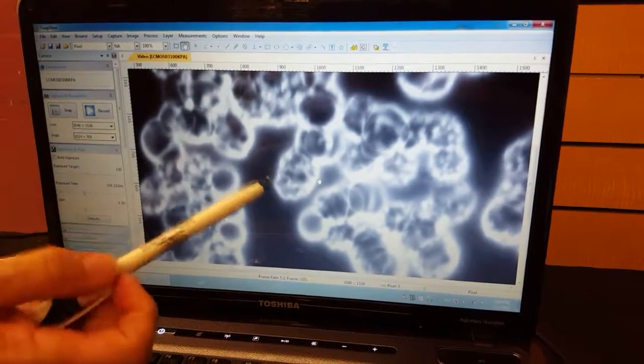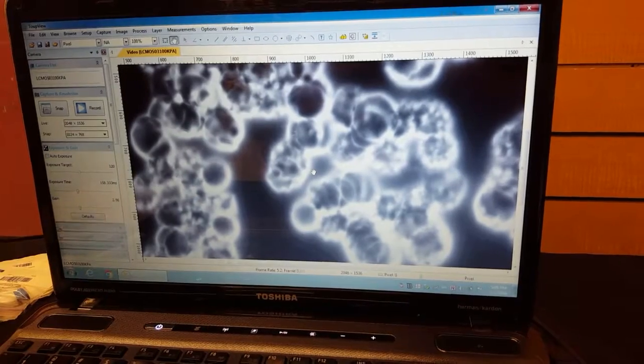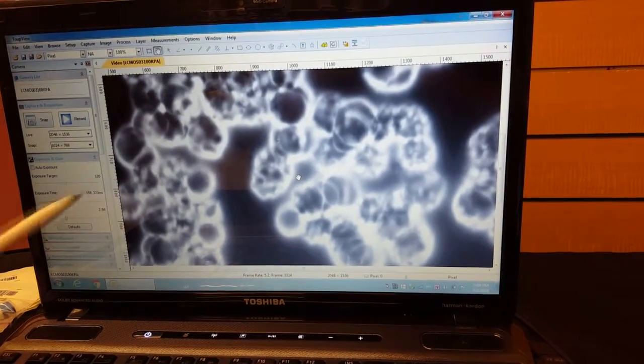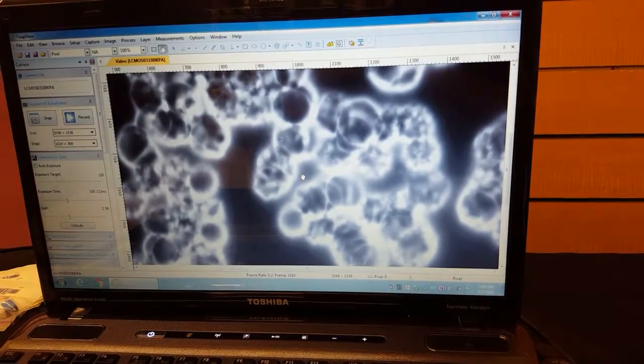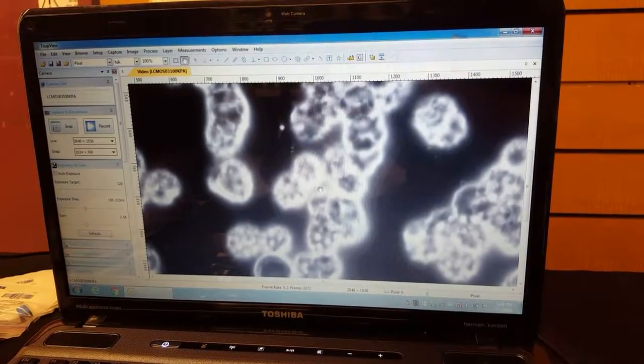Here would be a perfect cell. This is right here where you pretty much want to see a round cell with a light ring that looks like the sun shining. Right. That's good. That's a red cell you don't want to have there. Let's see, move around a little bit. And there's a lot of parasites, so you definitely want a paracleanse.